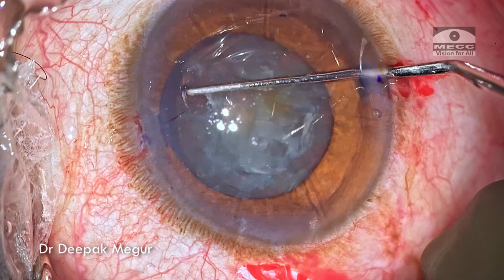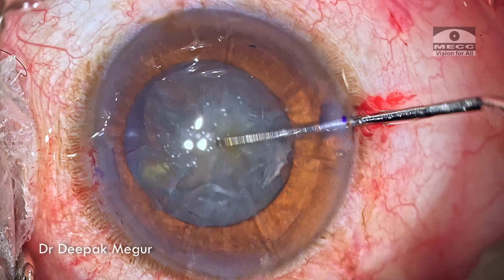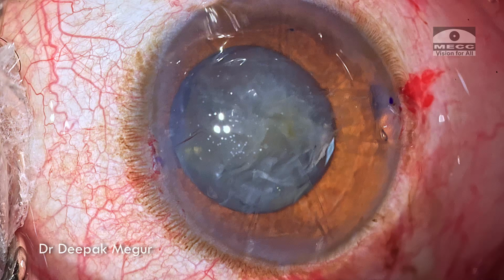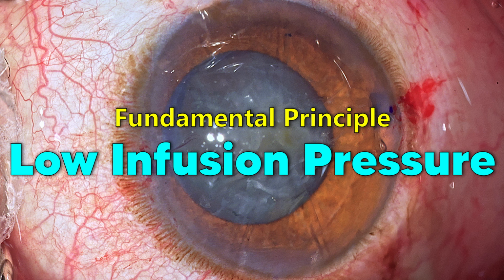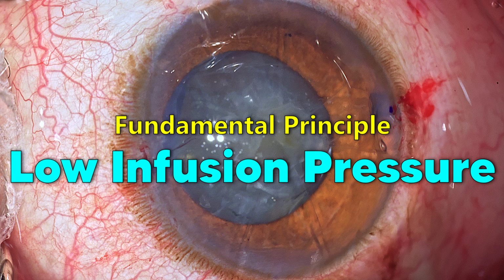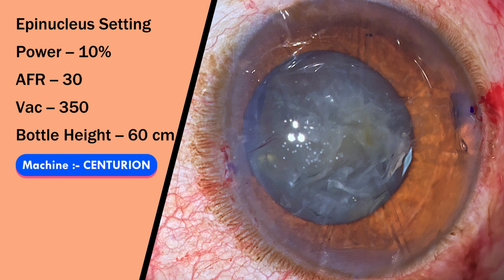The nucleus is slightly on the softer side, and the strategy which I am going to use for emulsifying will be like this. So the fundamental principle I'm going to use in this case is to use a low infusion pressure. I don't want the intraocular pressure to be high, which can result in these cuts getting compromised and some of them can open up. So I'm planning a low pressure surgery.